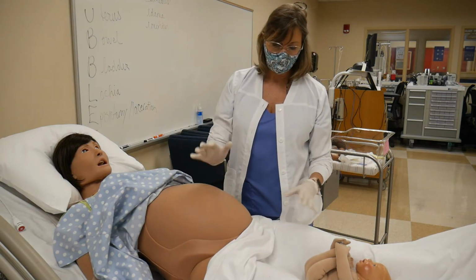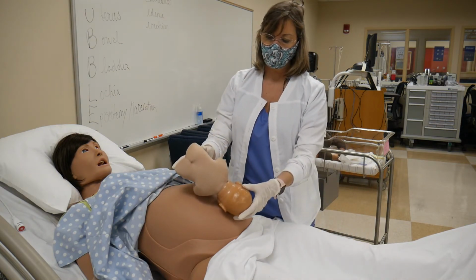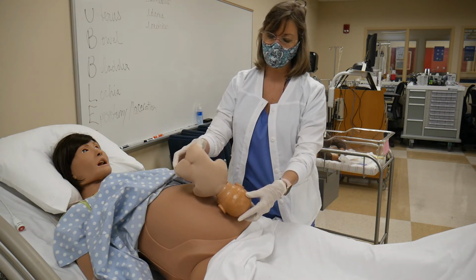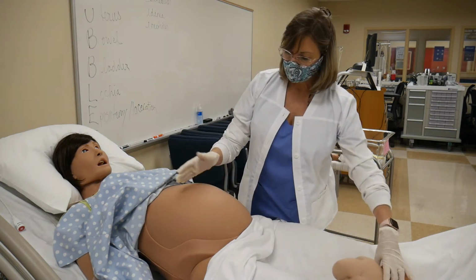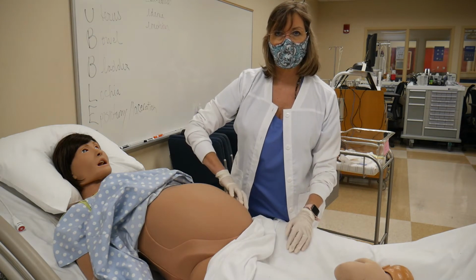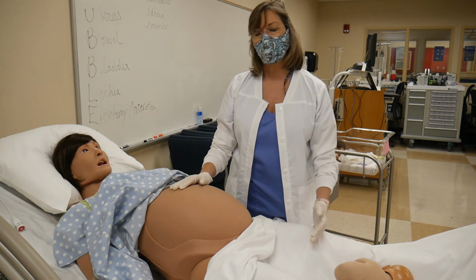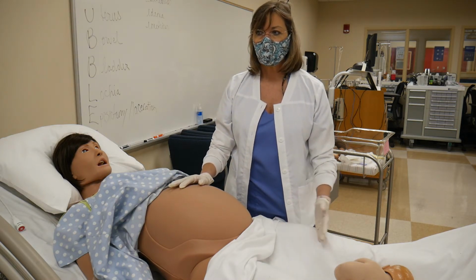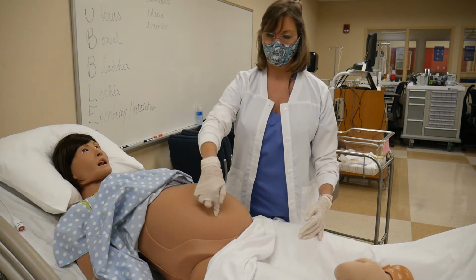But most of the time they're head down and they're either right occiput anterior or left occiput anterior. So most of the time we're going to find heart tones in the right or left lower quadrant. If mom's been monitored before, they've been checking heart tones in the doctor's office, you can always ask, where have they been finding the heartbeat? And a lot of times it's always right here.